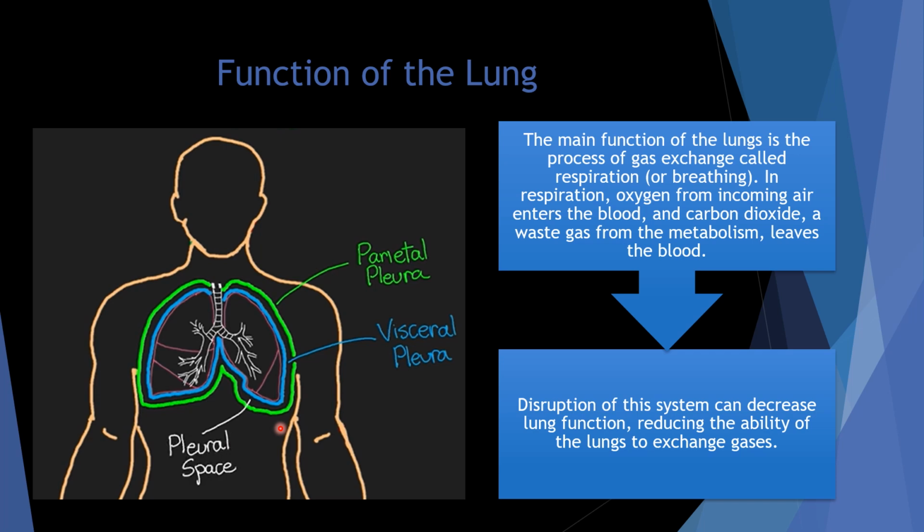You can move it around, you can slide it all over, and you get all this wonderful gliding, and you can run it all around that tube, but you pull it straight up, it doesn't come up. And sometimes I even had to slide it all the way over to the edge to release that suction in there, right, in order to get the glass up. That's coupling. And that coupling is what helps to keep the lungs expanded.